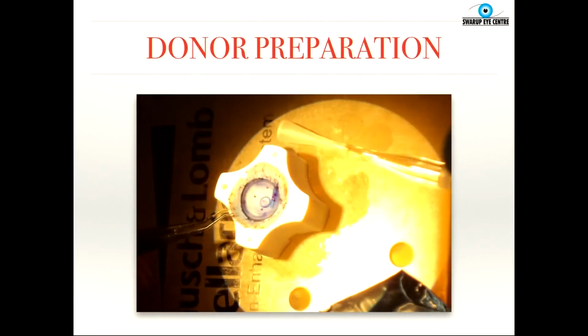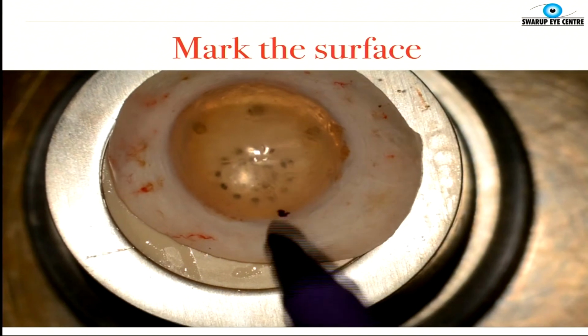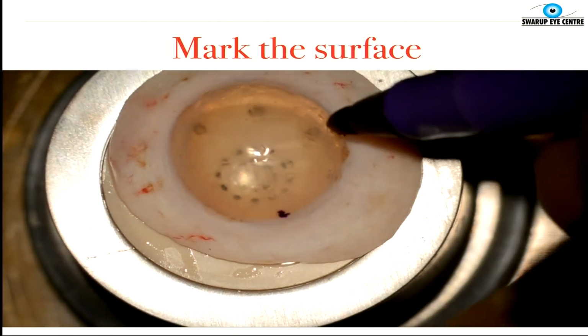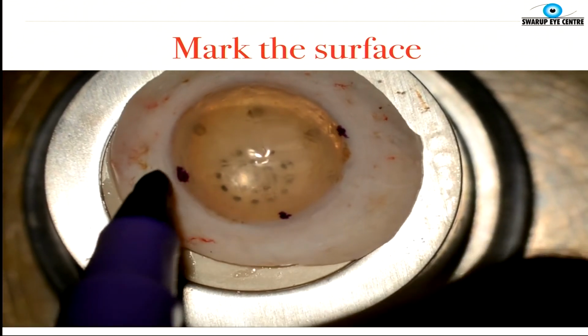So I'll just run through the surgery. The donor preparation, this is partly covering my second talk as well. So basically you need some sort of a Teflon block on which you can keep the corneoscleral rim. Initially it's a good idea to mark the limbus so that when you invert the graft you know the borders of the limbus.